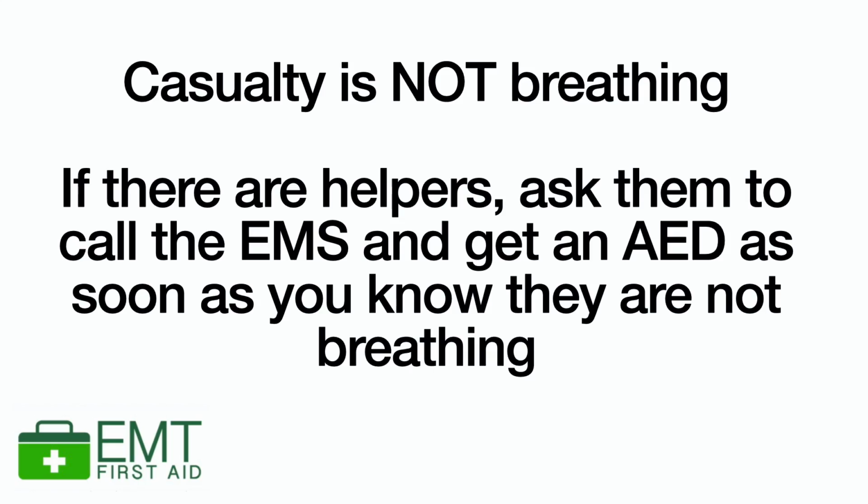Let's talk about what we'd do then if there was a helper there with us. What would we do? Well, quite simply, one person will begin the CPR straight away, because remember we talked about that being really important in the chain of survival, while the other person goes and calls the EMS, and then they will make sure they grab the AED. When that person comes back, they will take over the AED while you carry on with compressions.